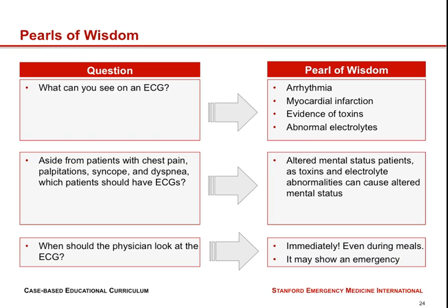When should the physician look at the EKG? The answer is immediately. Even if the physician is on break, the physician needs to look at the ECG immediately, because all of the things we're talking about as potential diagnoses we can see with an ECG, arrhythmias, myocardial infarctions, toxins, abnormal electrolytes, these are very, very dangerous conditions that require immediate action to prevent disability and to save the patient's life. In other words, the ECG could reveal to a trained physician the presence of an emergency. So the physician needs to see each ECG immediately to see whether or not an emergency is present. Not every patient who is very, very sick looks very ill.